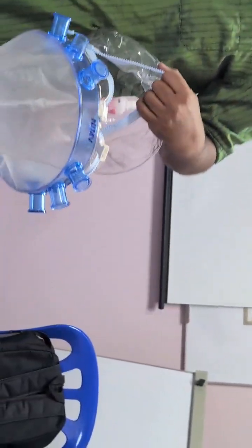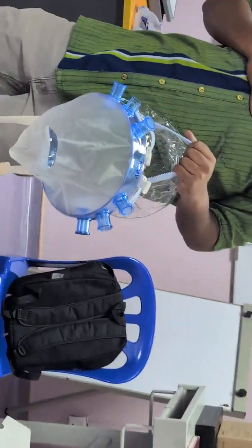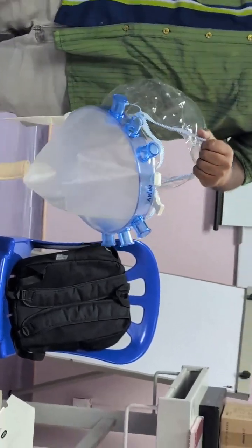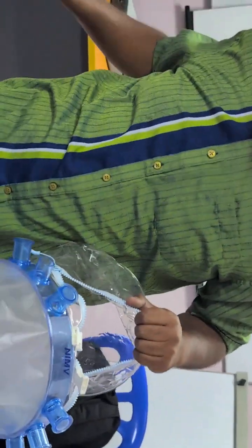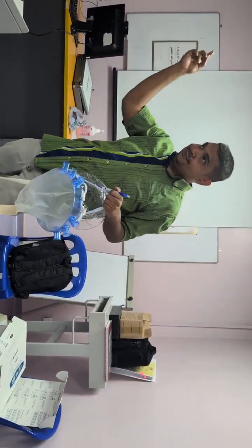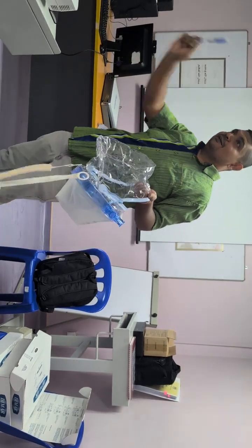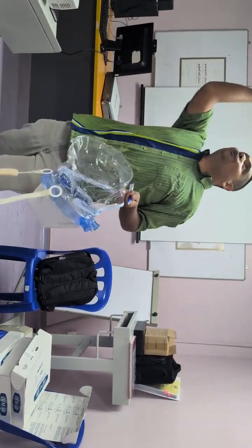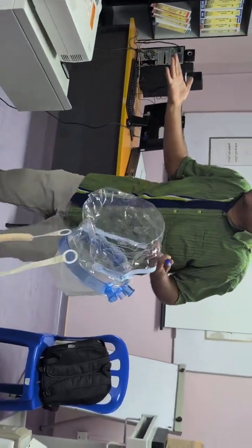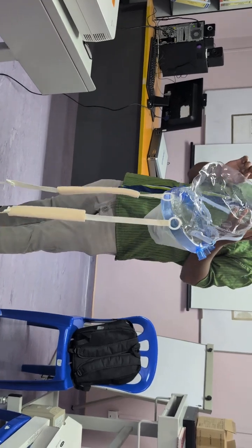I told you all the advantages. I'm going to tell you one disadvantage which I have seen. When the patient vomits. Okay? When a patient vomits in a CPAP mask, that flow will be zzz, zzz, zzz. When a patient vomits in a BPAP mask, that one even better. When he goes whoop, you release it. Okay, I mean that's how the machine works. Alright? So that's the only disadvantage which I have seen.